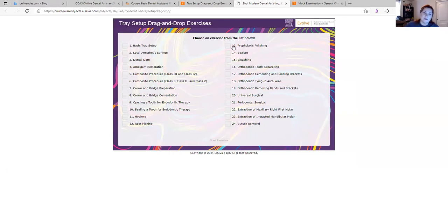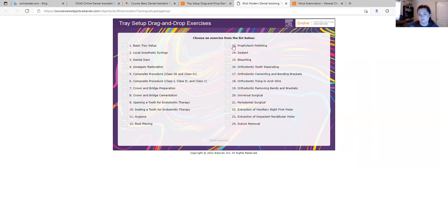Now, most of the offices I've worked in, there's not really a correct placement of instruments. Some offices do have that. My office, they kind of just get all messed up and we just organize them when we open them for procedures.